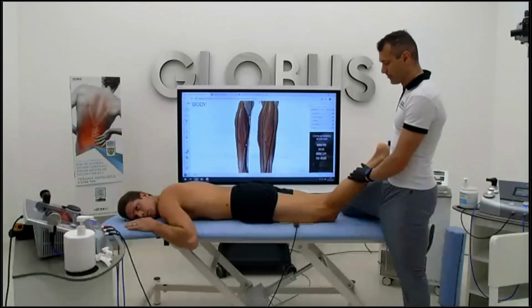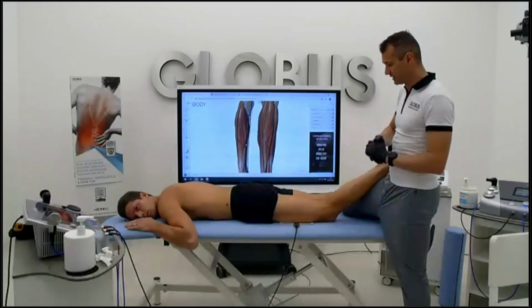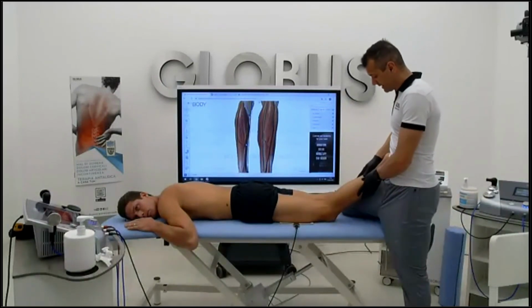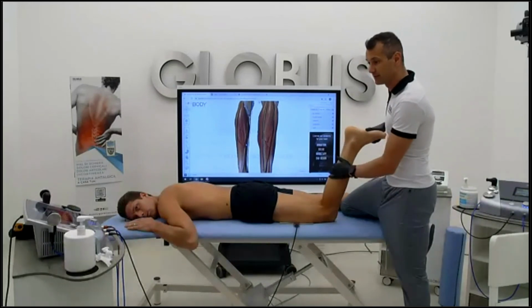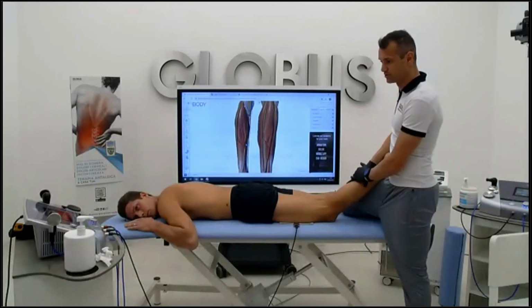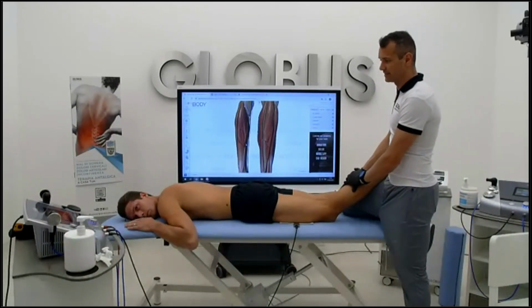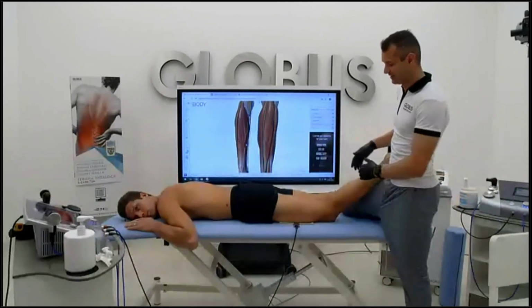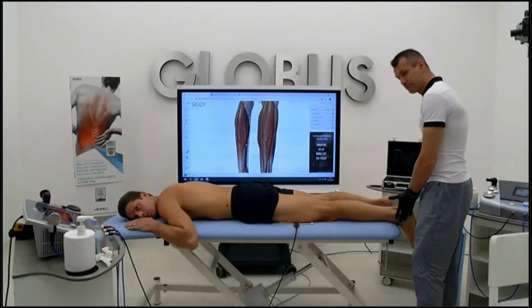You see that the fascia doesn't work, you explain to the patient, then you do the treatment with a fascia tool, or whatever you want, and you can show again that things have changed. It's a very important tool also to educate and, I can say, convince the patient about your job.